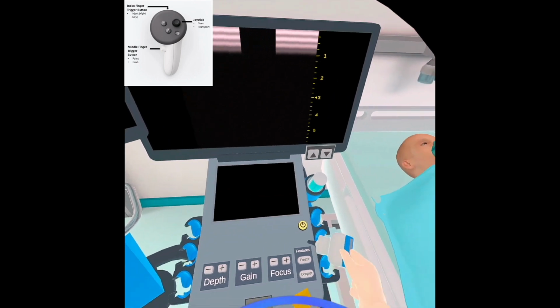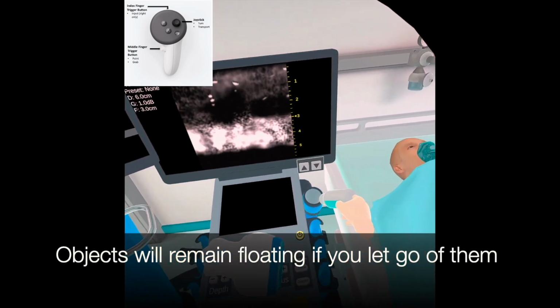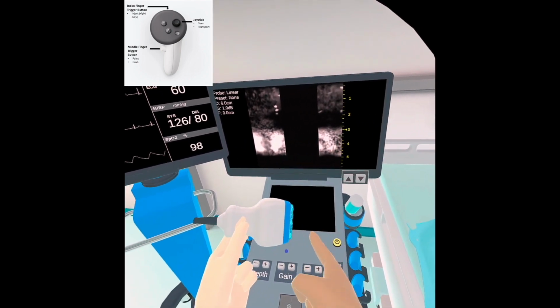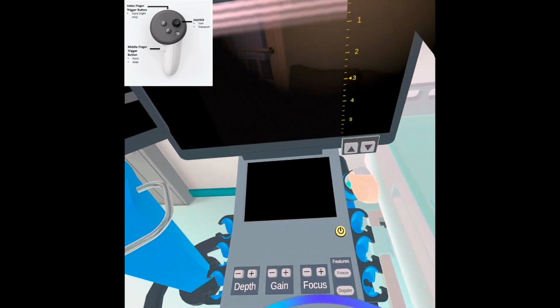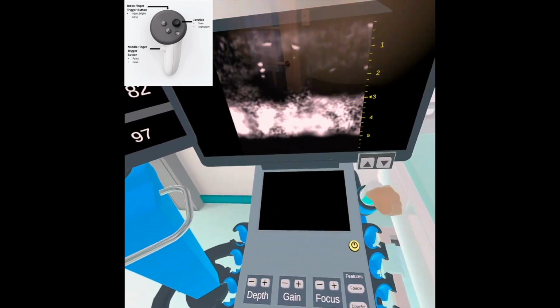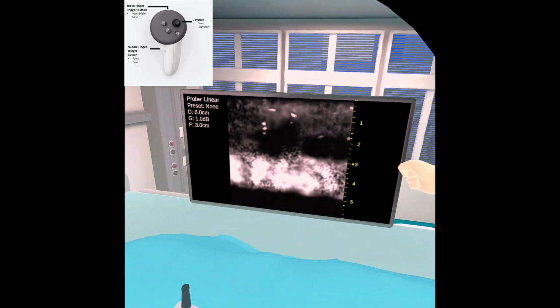Grab the ultrasound probe, apply gel using the provided gel bottle, and tap the probe to confirm orientation. A wipe is also available to remove excess gel. Hold the probe and begin scanning over the prepped area. You may adjust the display screen for better visibility.